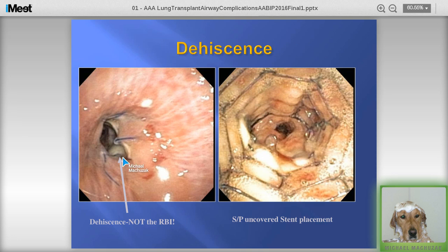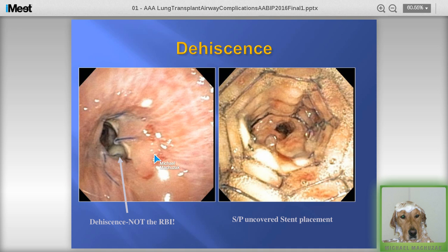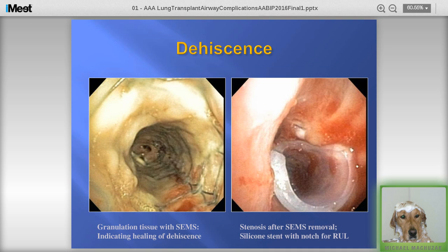Regarding dehiscence: I was called to the bedside the day after Christmas about seven years ago. The surgeons called me for what appeared to be a completely obstructed bronchus intermedius. This was actually a dehiscence — what was obstructing the bronchus intermedius was mediastinal tissue. You can see where the airway should be, and all of this is displaced airway wall. A metal stent was placed — published in the Blue Journal in 2006 — using a non-covered metal stent kept in for two to four weeks, allowing granulation tissue to form, then removing and sometimes replacing it. This led to significant improvement in the dehiscence in most cases and avoided surgery. We haven't had to go back in for surgical dehiscence in quite a long time at our institution.